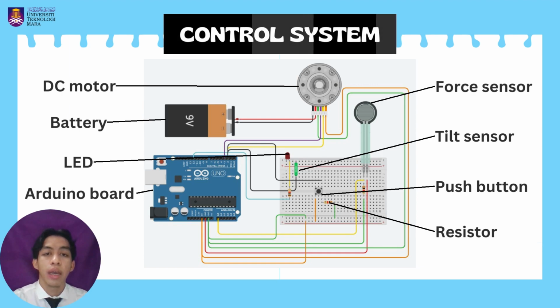to the circuit, an Arduino Uno R3 serves as the brain of the AFO and controls the operation of the SEA. Next, a force sensor measures the force applied by the SEA, while the tilt sensor measures the angle's rotation of the ankle. Also, a DC motor is used to actuate the SEA. Lastly, the wiring and connectors connect all of the above components and allow them to communicate. The specific design and components of the circuit may vary depending on the specific requirements of the AFO and the goals of the design.